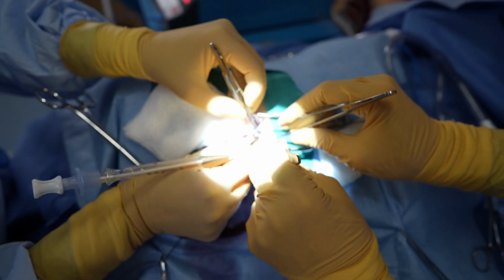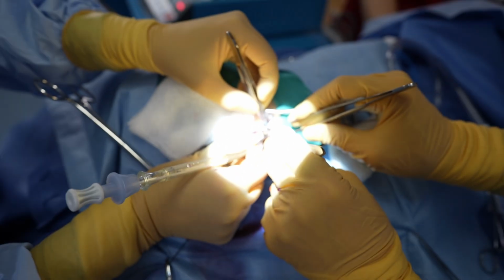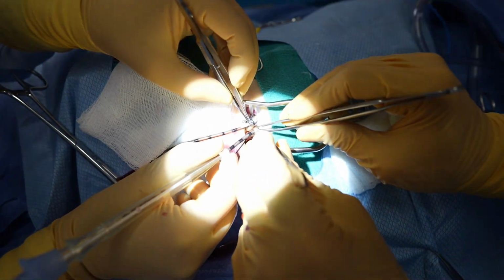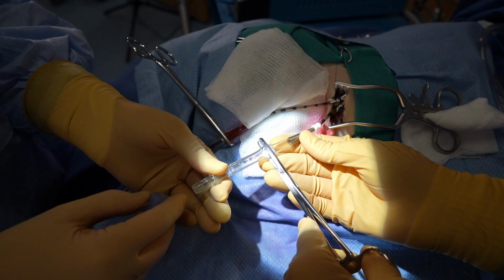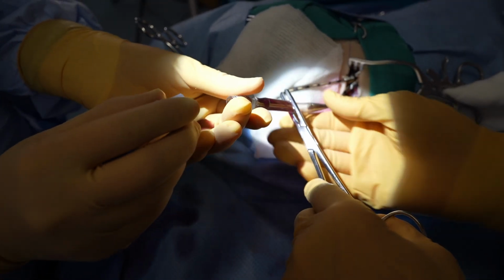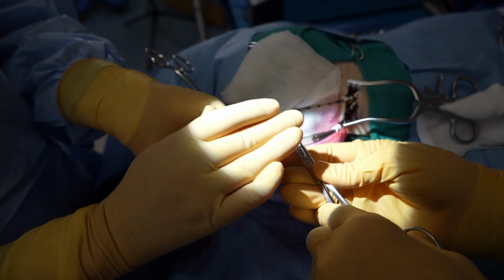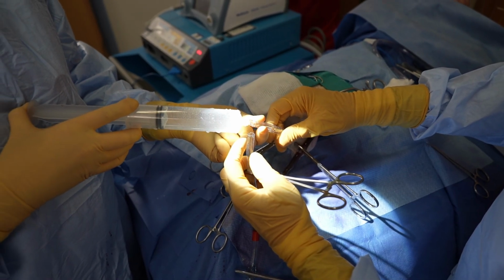Again, we make sure to control for bleeding out of the vessel while placing the cannula. After we secure the cannula in place in the same manner as we did to the artery, we will allow for backfilling of blood into the cannula after removing the obturator and allowing blood to passively fill into the vessel.